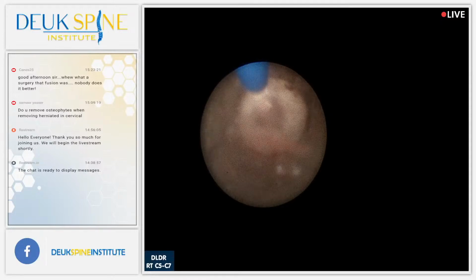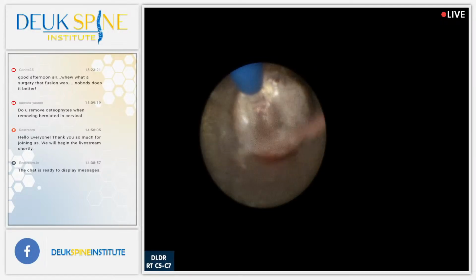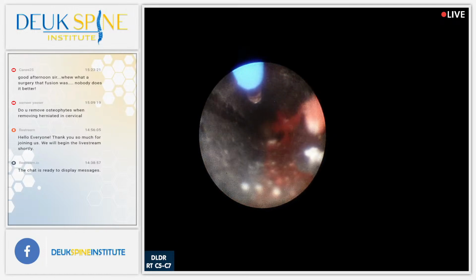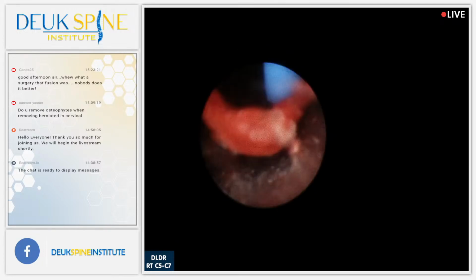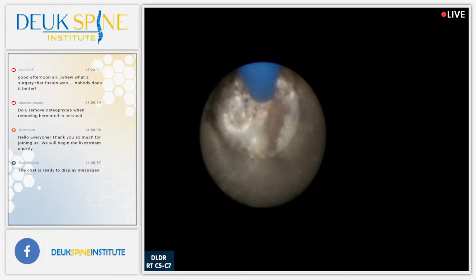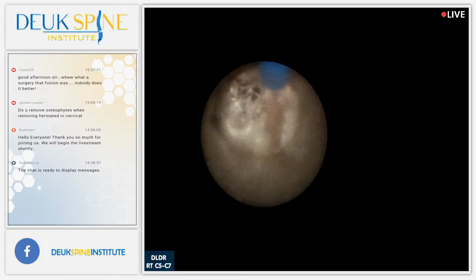There we go. Good. Well, we're definitely in the disc. Same story. Lots of bone spurs. A lot worse. The yellow white shining. Is the laser on? Yeah? Let's flip it. Same thing as that last disc, guys. Just horrible spurs. Horrible, horrible. Yeah. That's crazy.